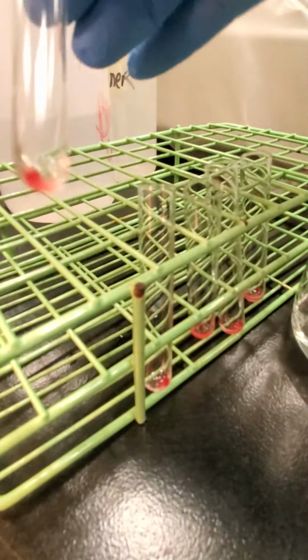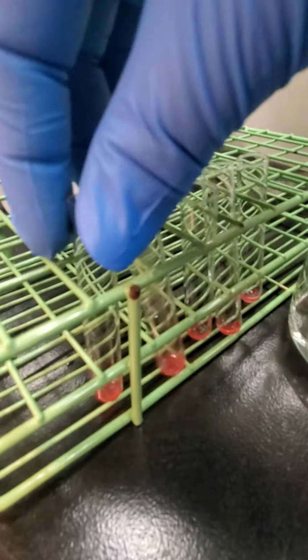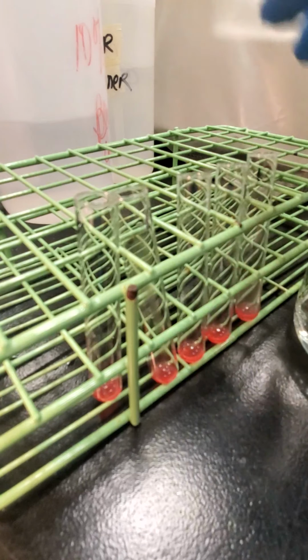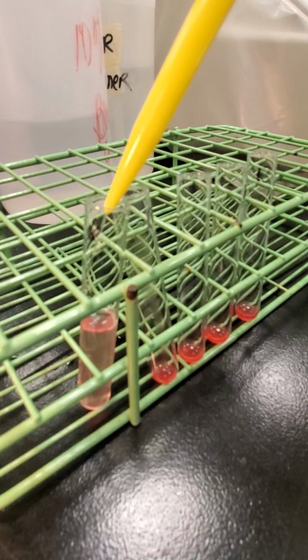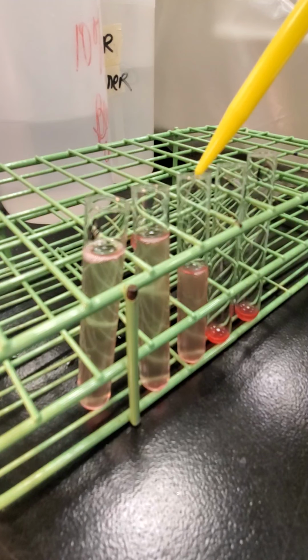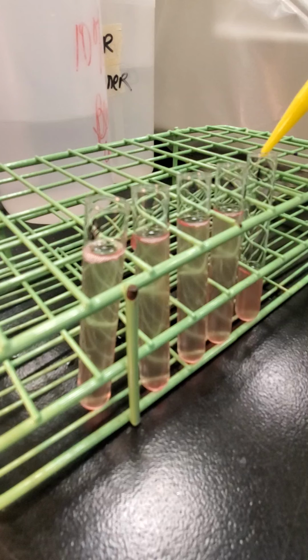If you notice, the red cells stayed at the bottom of the tube. There is a little bit of residual saline, so I'm just going to mix those up a little bit to wash them extra good. Kind of disperse those red cells again, and I'm going to do the process all over again. I'm going to fill these all the way up with saline and put them into spin for another minute. I'm not going to bore you with this process, but for my last wash, I am going to dab them with gauze or Kim wipes or paper towels to get a dry cell button. So I'm going to do this an additional 3 times.